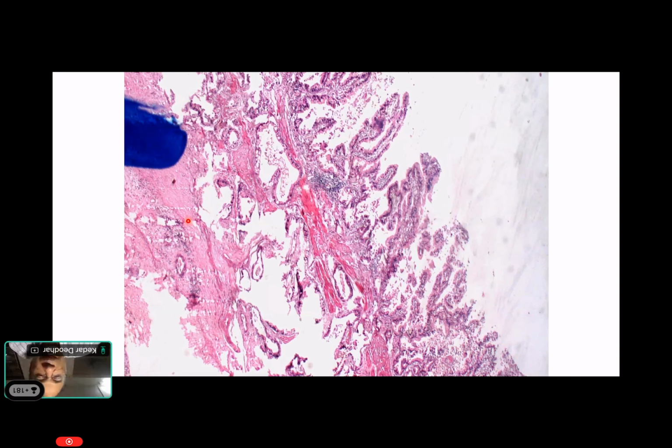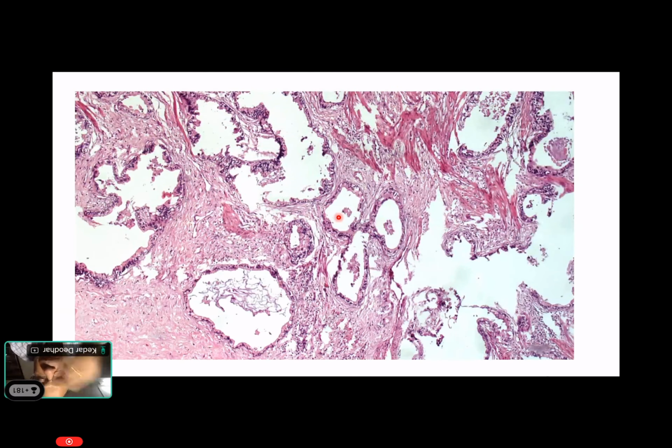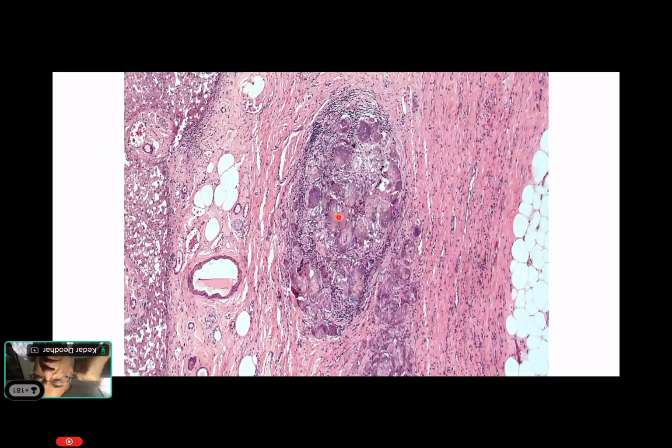Again, an example of pT2a gallbladder cancer, adenocarcinoma, moderately differentiated, typically in a revision cholecystectomy. Meaning the gallbladder is removed, we found cancer, and the surgeon has gone back to resect the gallbladder fossa area and the local nodes and part of the liver parenchyma.